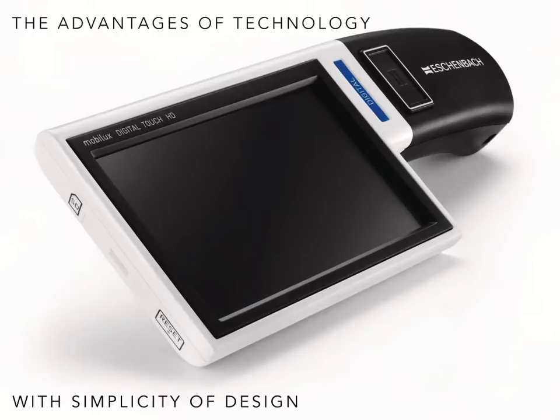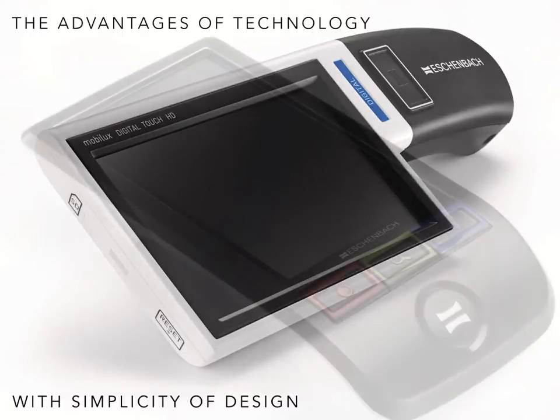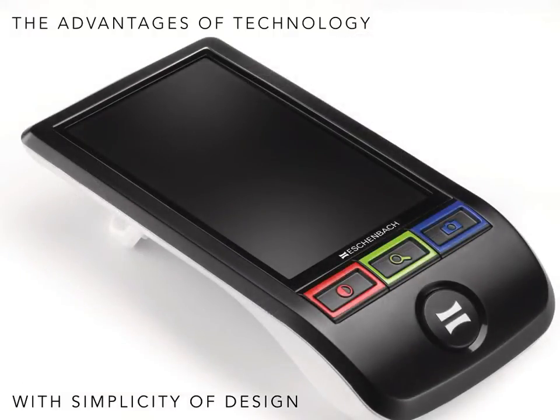This short presentation will review the basic principles common to all electronic devices, illustrated by Eschenbach's two portable handheld systems: the Mobilux Digital Touch HD Magnifier and the SmartLux Digital Magnifier. We'll touch upon how the advent of digital technology has improved the scope and functionality of this range of low vision devices.